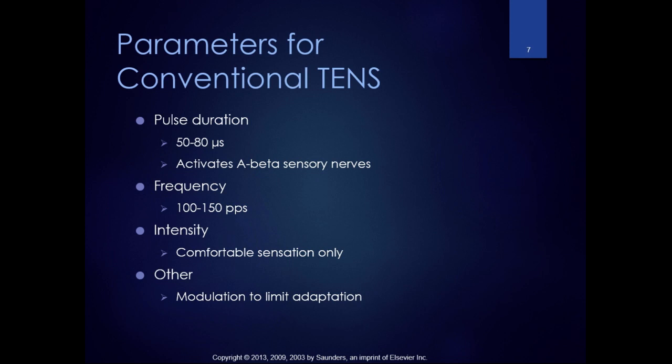So the home units now are so simple. They don't require knowing any of this stuff to use them. But when I'm telling people any kind of pain management electrical stim, whether it's TENS or something else, usually the first time I use it with someone, I'll say, okay, I'm going to turn it up and I want you to tell me when you first start to feel something. And so hopefully they tell you. And then I say, okay, now that you're feeling a little tingle, I'm going to turn it up more until it feels strong but still comfortable and not twitchy at all. And that's usually a good cue that gets people to the amplitude that you want.